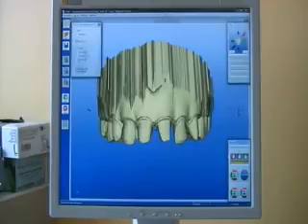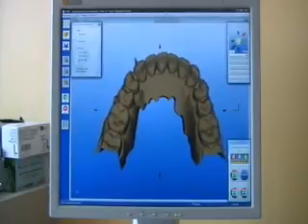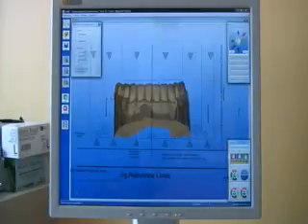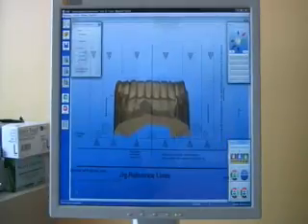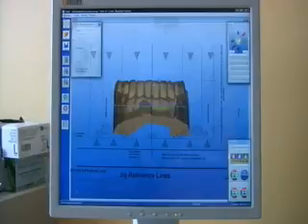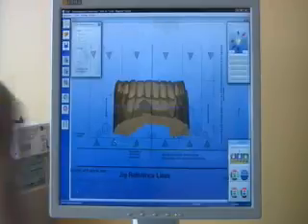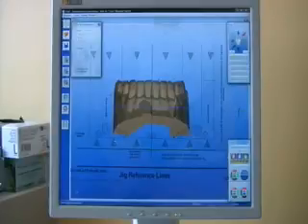Highlight cut inside, and we will go and take our antagonist model, rotate it so we see the facial view. And with the use of the overlay, we will then define our horizontal line or occlusion line. Using the correct optical impression, the superior line will be parallel with the horizontal lines of the overlay.